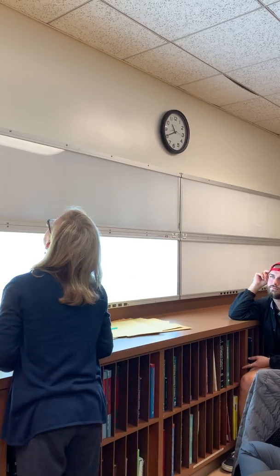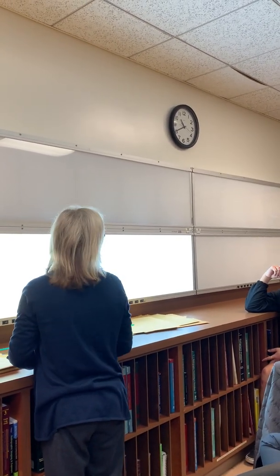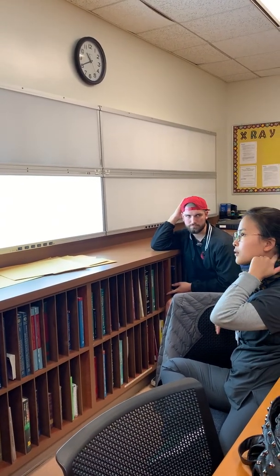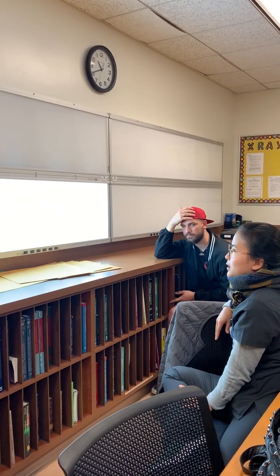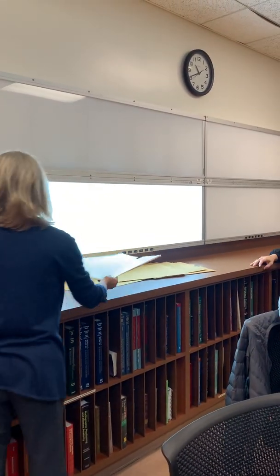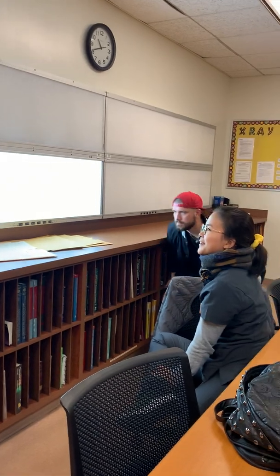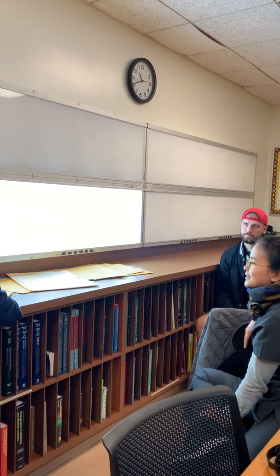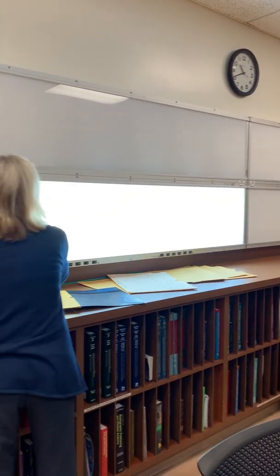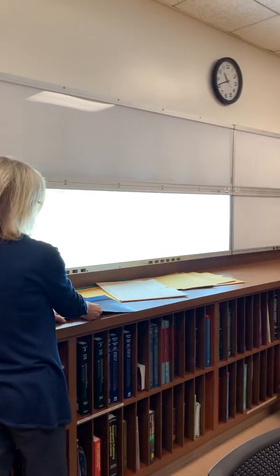Do you still go like this, or do you do the opposite? No, you still go like this except your PA. But wouldn't the Fuchs be less OID than the PA Waters? That's what I was just thinking. It would. So would you prefer the Fuchs? Oh, definitely. But we teach everything, it's called true Waters. If you're doing a Waters, you're doing it mainly for facial bones and sinuses. So the PA is better because it puts it closer.